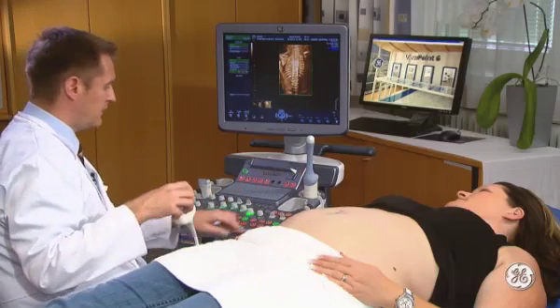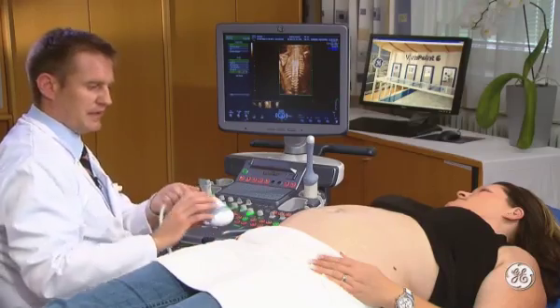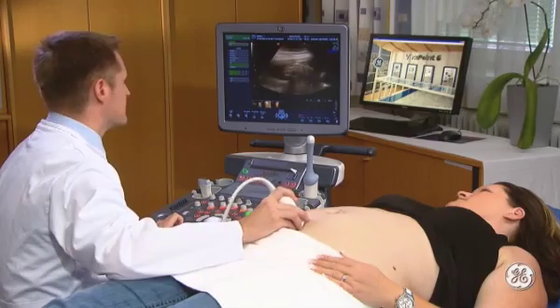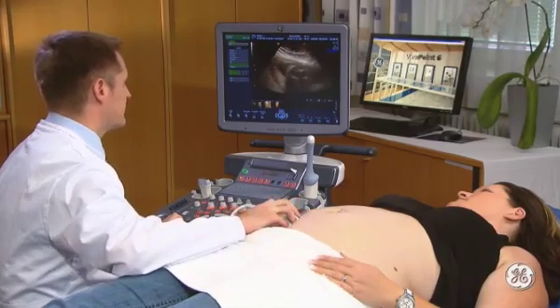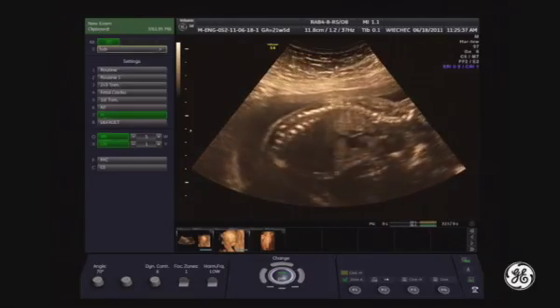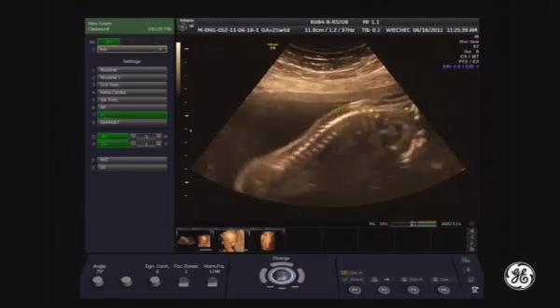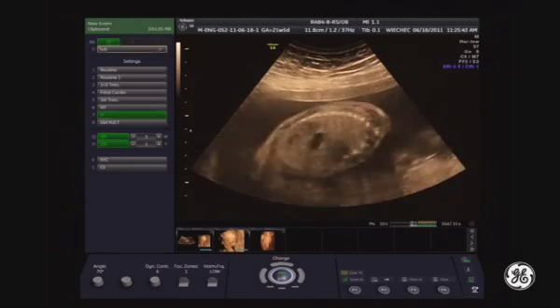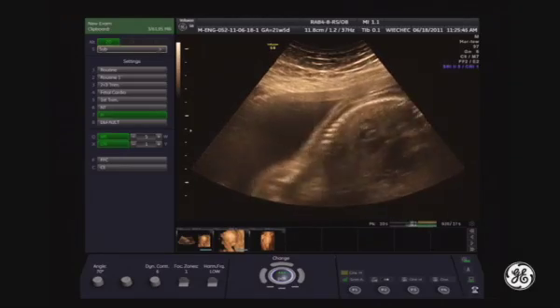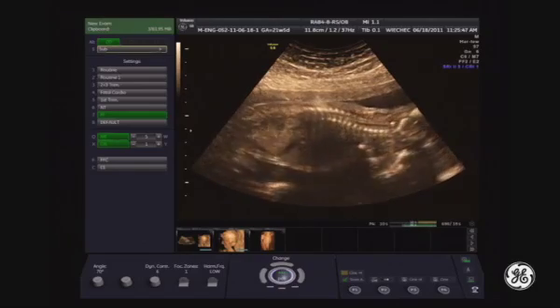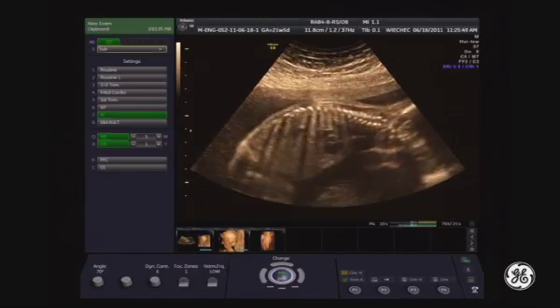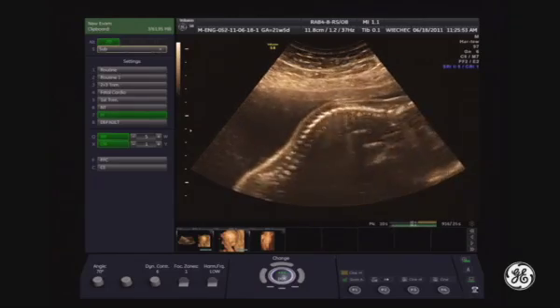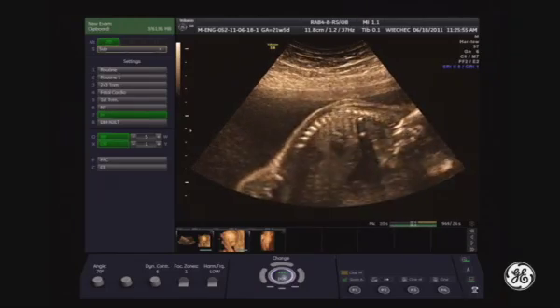I need to identify the plane from the very beginning. The dynamic technique is more often used when the fetus is active, as you can see here. If it is still, the 3D static acquisition is superior because it has better resolution.